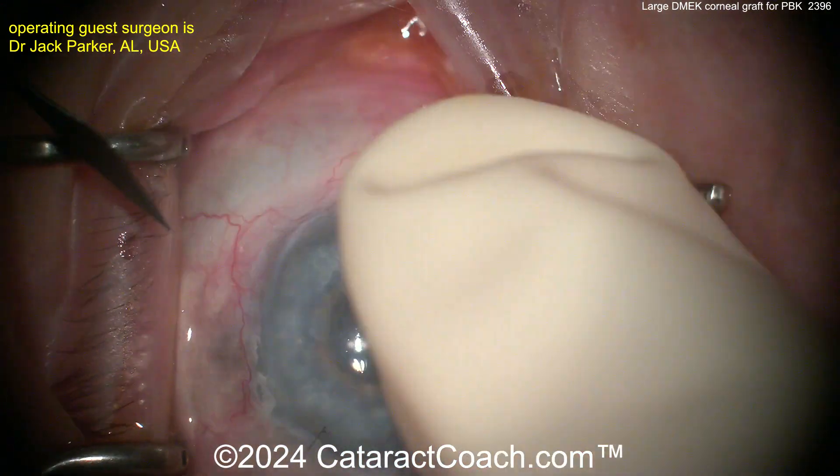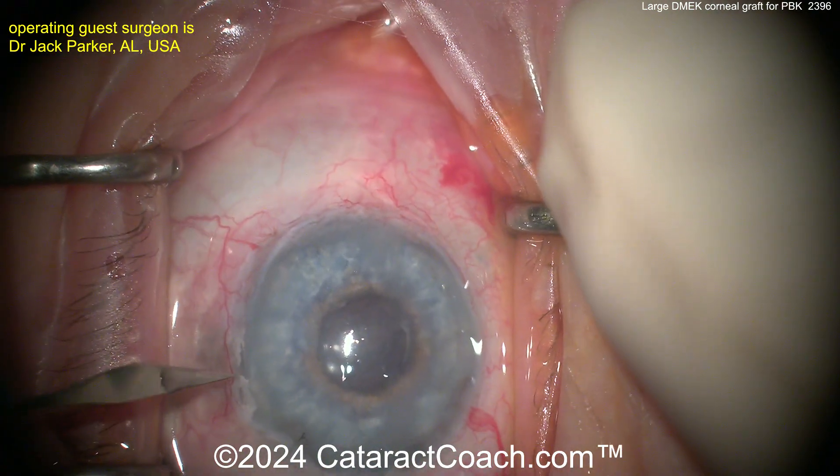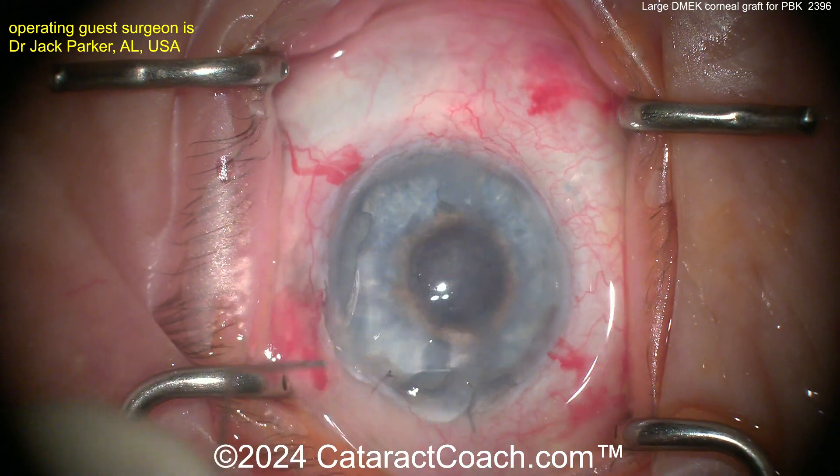You can see this patient has a complex history: there's a tube shunt, there's a Yamane IOL, post-vitrectomy, and even an artificial iris — that's not a regular iris, that's a prosthetic device here.